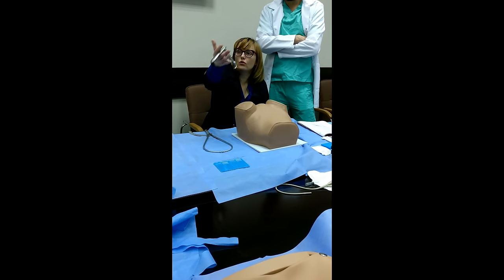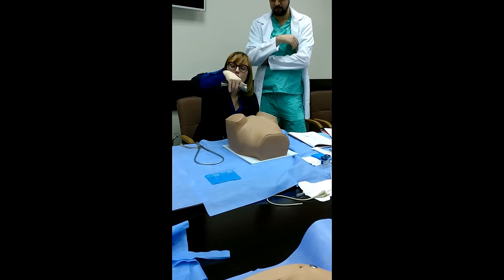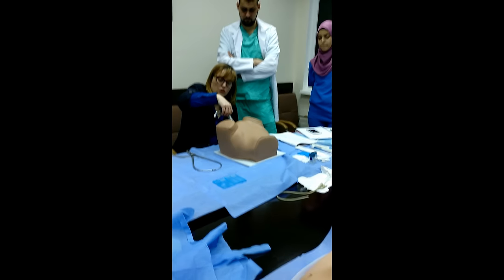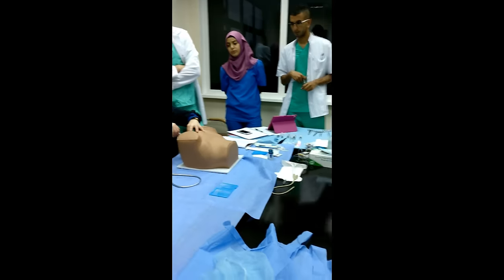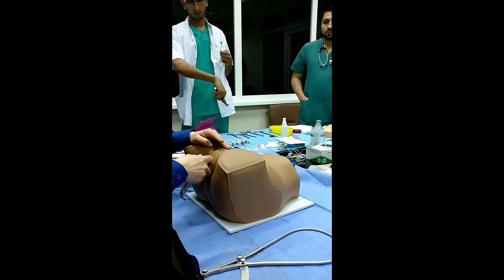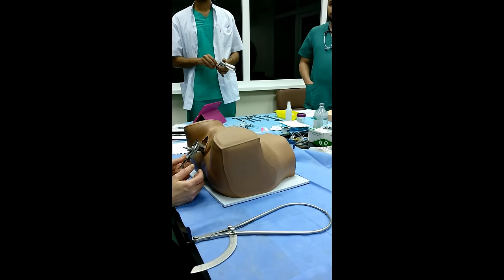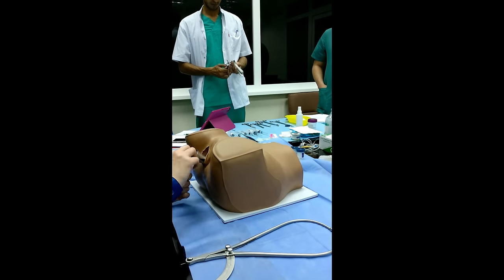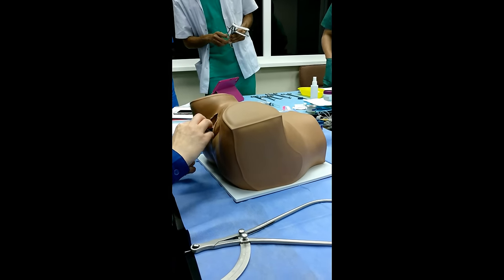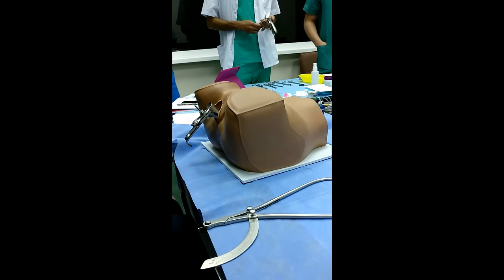This is the technique to hold the speculum for Cusco. The speculum is introduced at 90 degrees and 45 degrees versus horizontal. So we remove the labia, we introduce the speculum 45 degrees versus horizontal and simultaneously we rotate the speculum. After that, we open it and we expose the cervix and we fix it. That's it. You can see the cervix. You need a light.